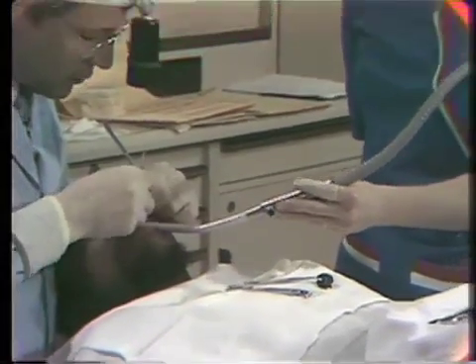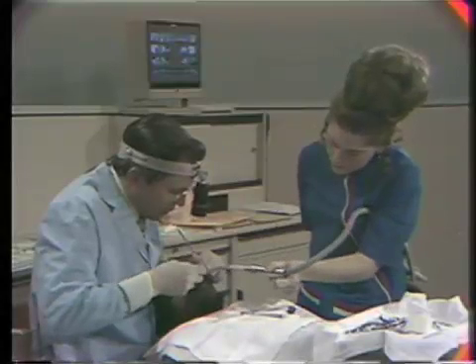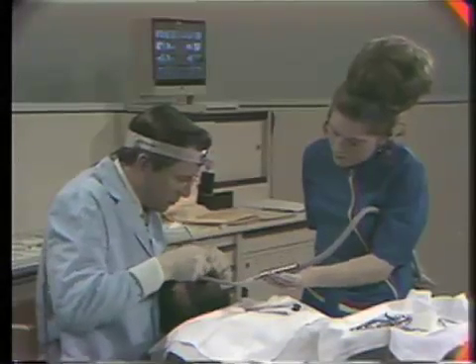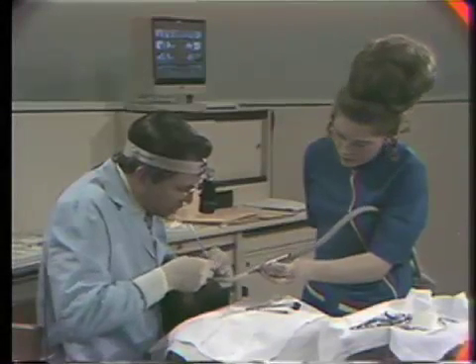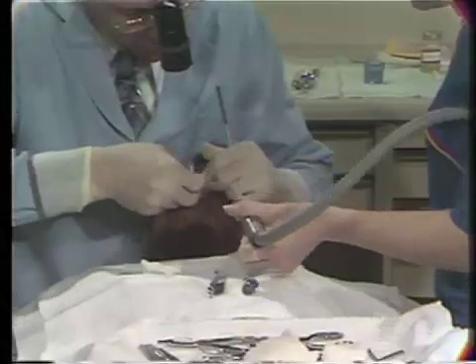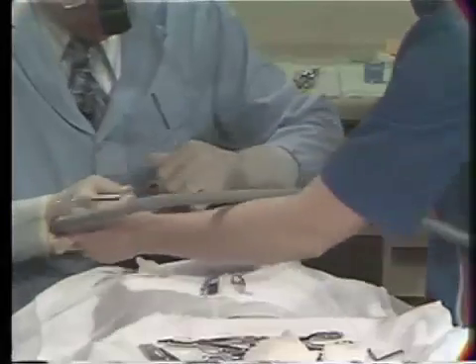And now with the evacuation from the lingual, I don't have to worry about any excess tissues in the labial because it draws through. I know the evacuation is making quite a little noise, but I hope you can hear the narration above it. As these tissues are now being removed, Mrs. French is picking them up as well as the liquid, so the tissue that's being removed around the teeth is going in the evacuation system and right out of the area of operation completely, which is a great assist. Now, Harry, turn your head a little bit. That's it, good.